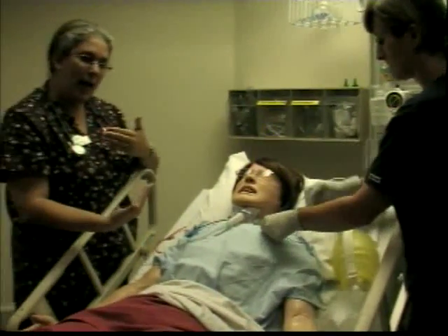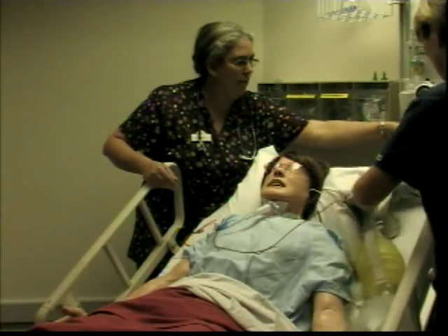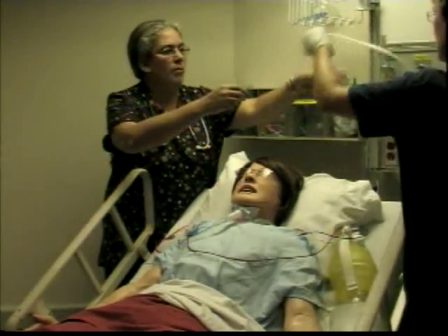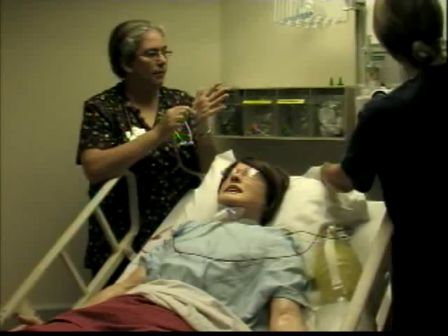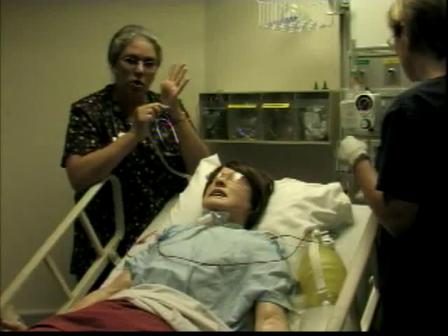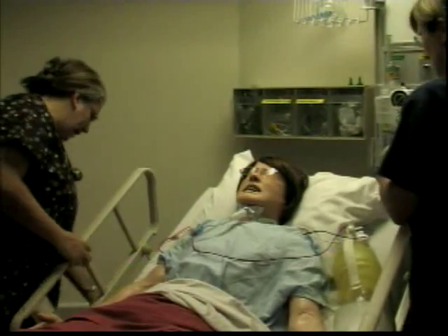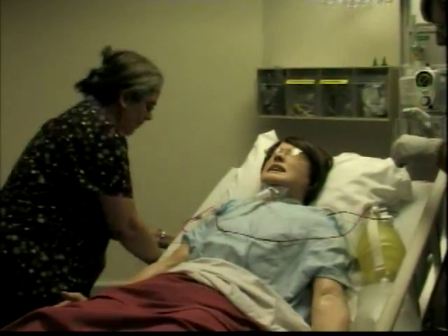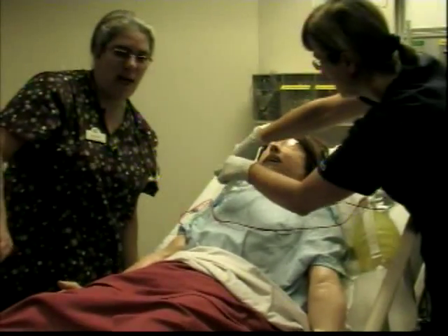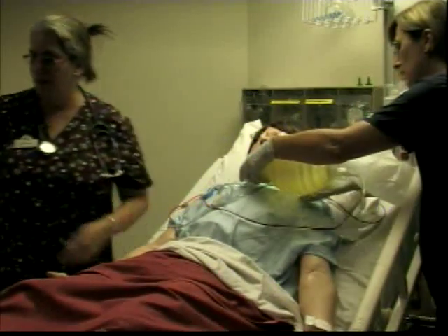I have her up as high as she can tolerate. I will ask, if I can have my suction catheter, Miss Faye. And can you turn it on for me so I can give it a quick check? Put it around 80. Okay, it is. All right, you can feel it; you get the little suction in there, okay? And I have it very available to me, easy going. I have the rails down. Mrs. Shapiro, I'm going to give you a few deep breaths with this special bag. Putting the whole bed a little bit higher for me. Okay, a few deep breaths.